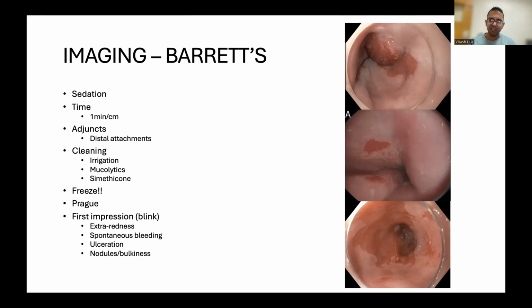Then there are other things that can help you when imaging these patients. One of the things that I am quite a fan of and do use often, and you'll see it in my pictures there, is the use of a distal attachment or a distal transparent cap. It's a little cap that goes on the tip of the scope. The value of that is that often you try to get up close to a lesion, and when that lesion comes against your scope, your screen, you get red out. So the cap just gives you that little bit of distance to keep the image off your monitor and to get you a nice image. You can also set the cap on a lesion, isolate it, and put that lesion under water by just filling your cap up with water. And water really does help to magnify images and give you much clearer pictures.